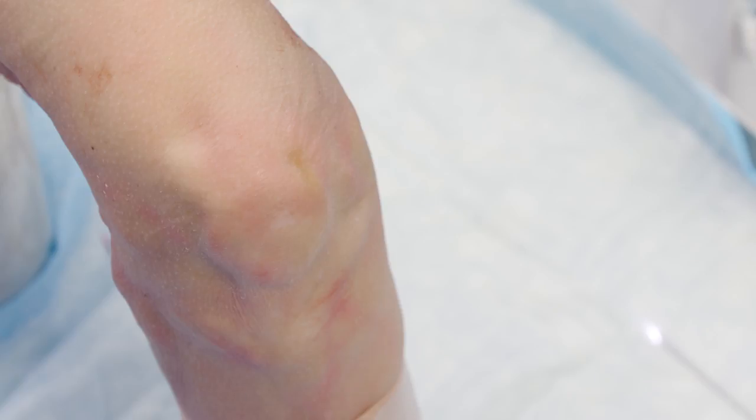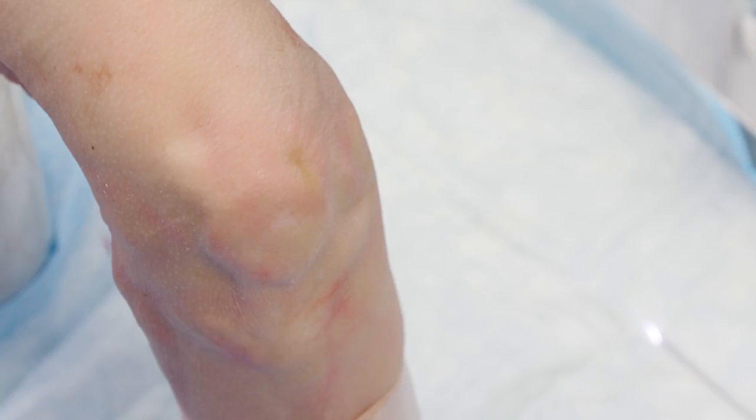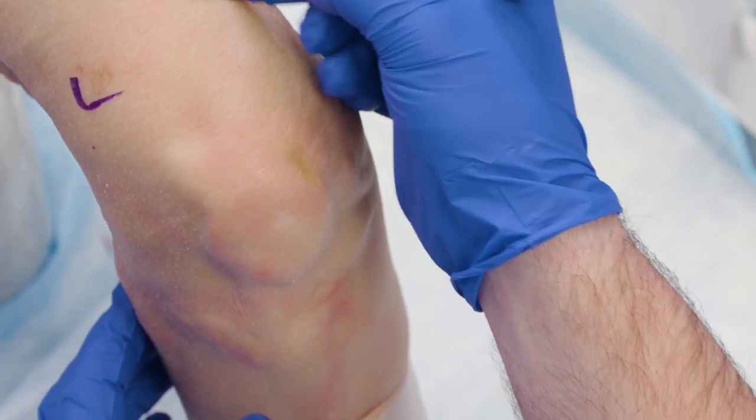Today we're going to talk about doing a knee-needle diagnostic arthroscope in the office. When setting this up, we're really trying to think about where the patient problem is — is there pain more medial or lateral? For the purpose of this demonstration, this is a right knee, so here we'll be talking about the lateral side and the medial side.